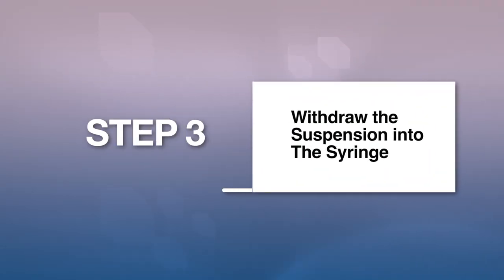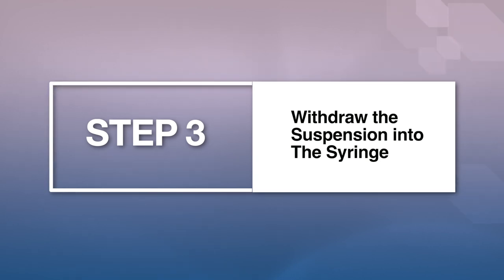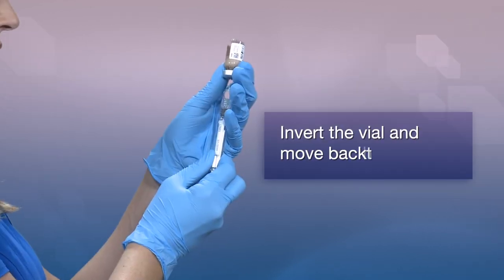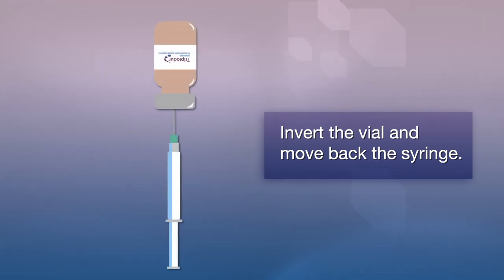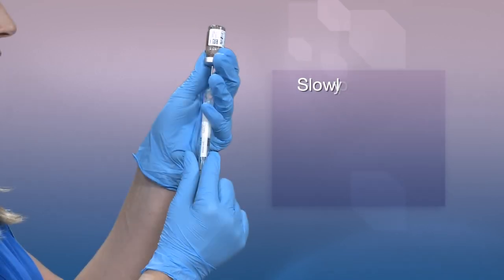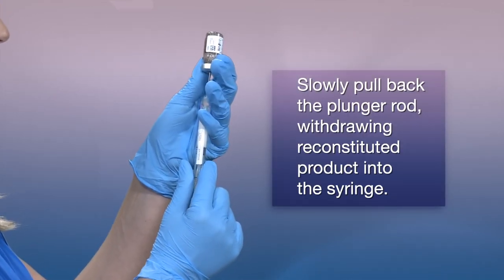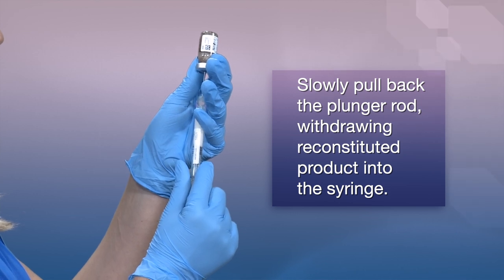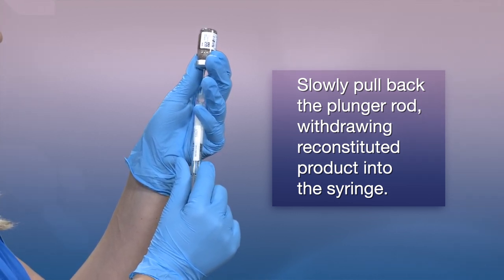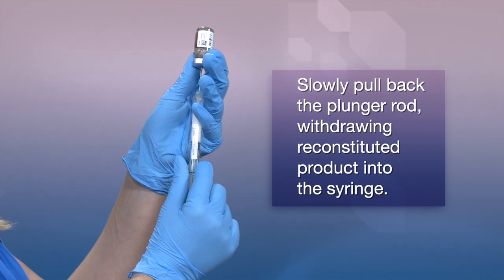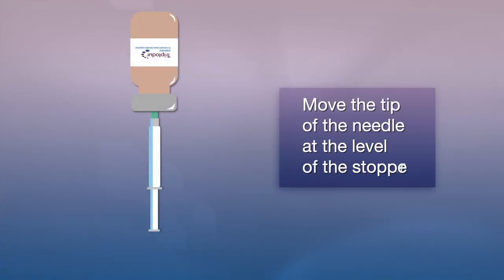Step 3: Withdraw the suspension into the syringe. Invert the vial and move back the syringe in order to position the end of the 21-gauge needle near the level of the stopper, making sure the needle lumen is still completely in the vial. Next, pull back the plunger rod slowly to withdraw the reconstituted product into the syringe, withdrawing as much of the reconstituted product as possible. Move the tip of the needle at the level of the stopper to be able to withdraw a maximum amount of suspension.